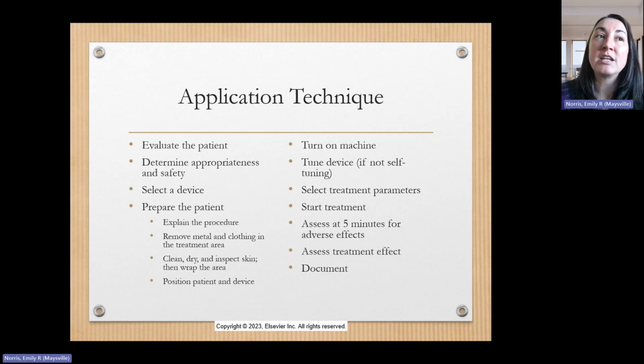But I don't personally know of them sending patients home with machines or anything. So it would be hard to get the amount of treatment recommended for a patient with that non-thermal diathermy, especially to be in a clinic for an hour at a time, just sitting under a machine. That is going to be pretty uncommon in most treatment facilities.